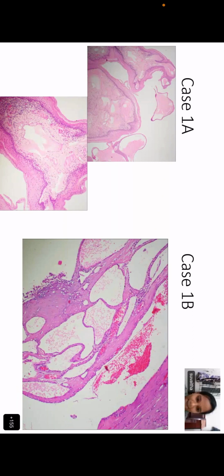Now I want to ask the three of you, well, Limpy is not there, but those who are here, including Dia: do you agree with Dia's use of the word secretion? I said exactly what Dia said. So now, Vimi, you agree with the word secretion? Not a secretion, ma'am. Actually, it's a pale eosinophilic material that is being filled in the area.